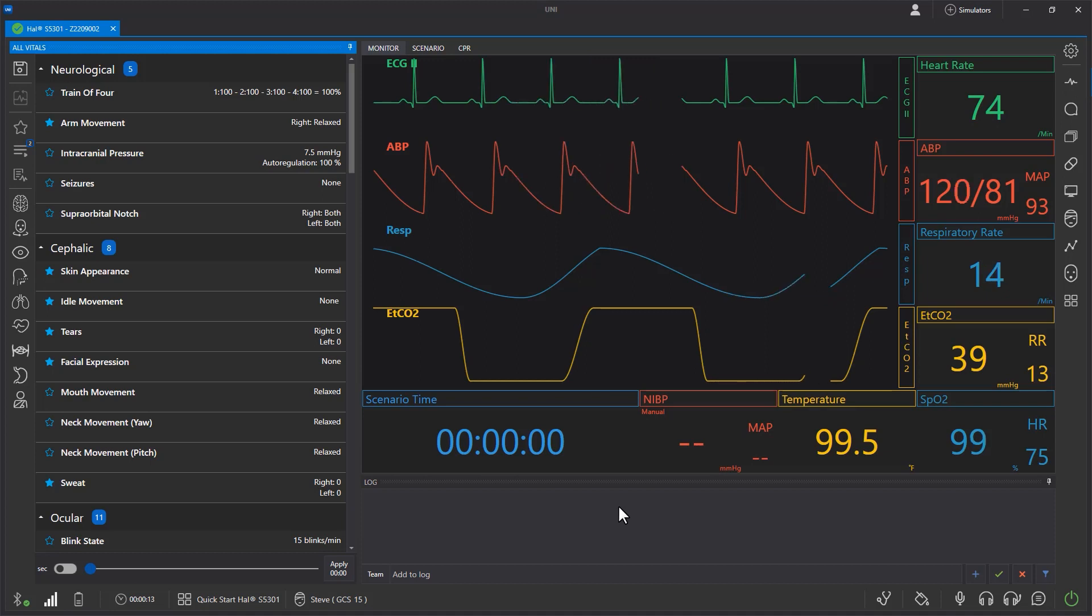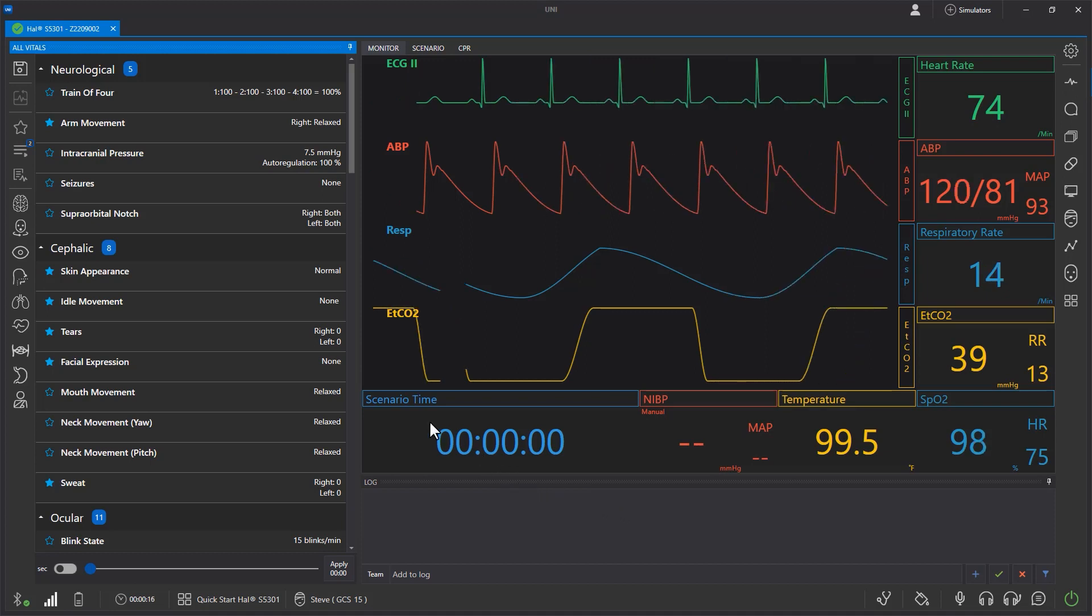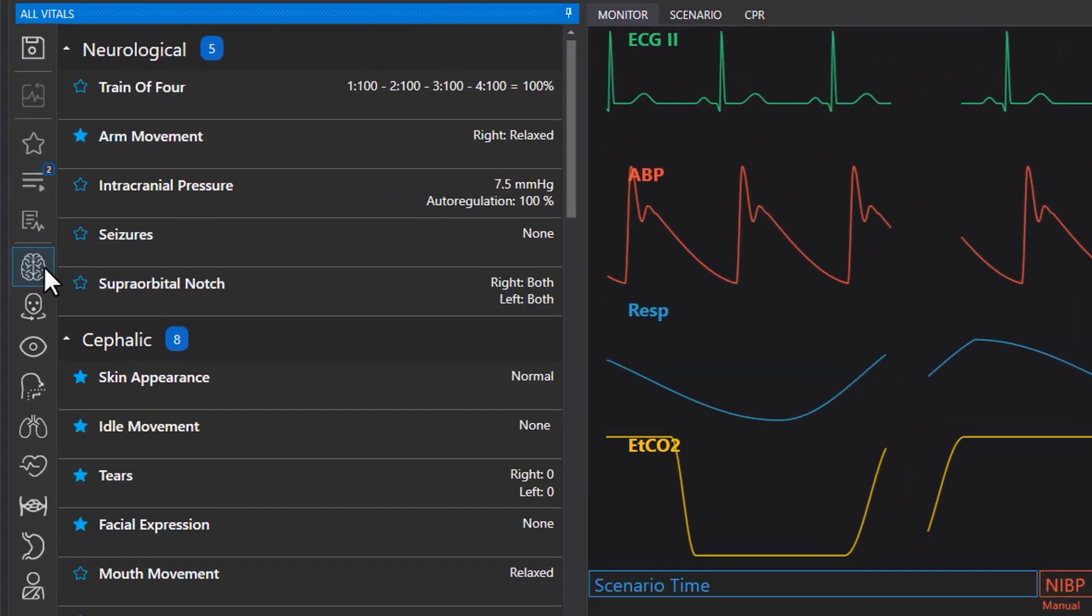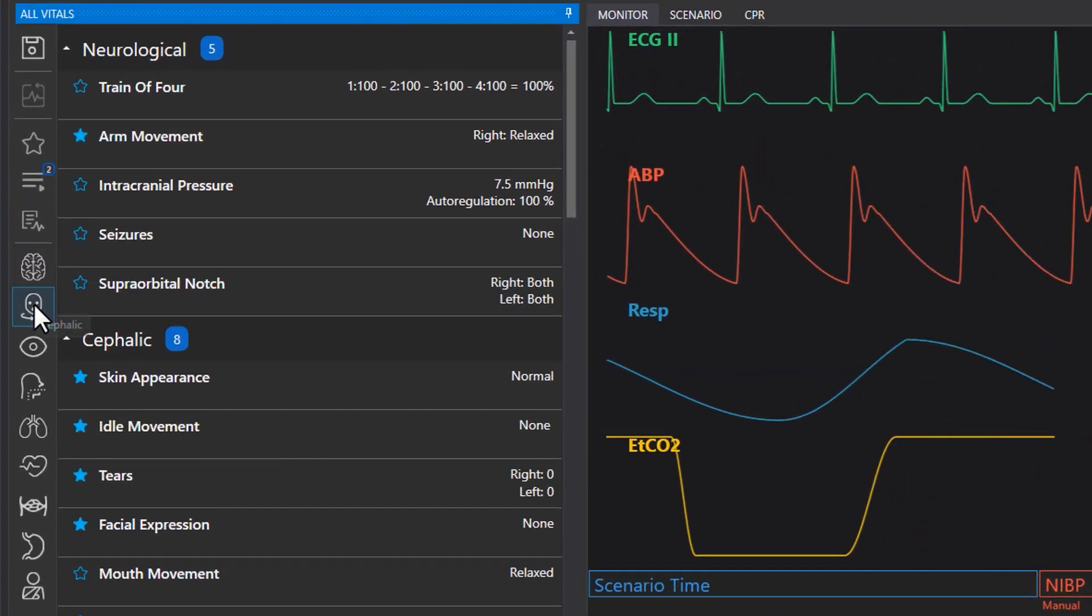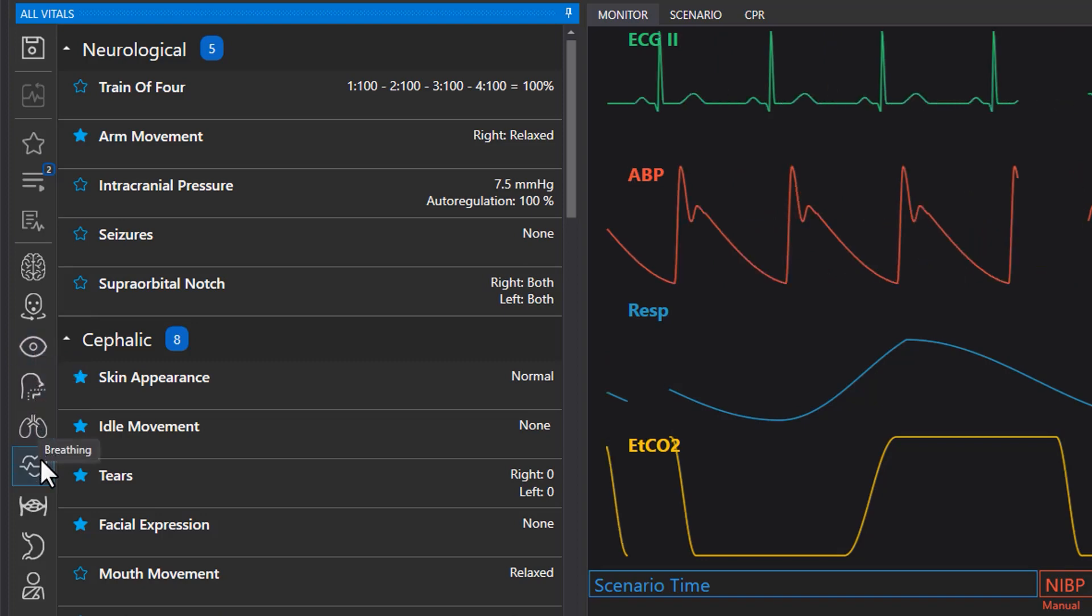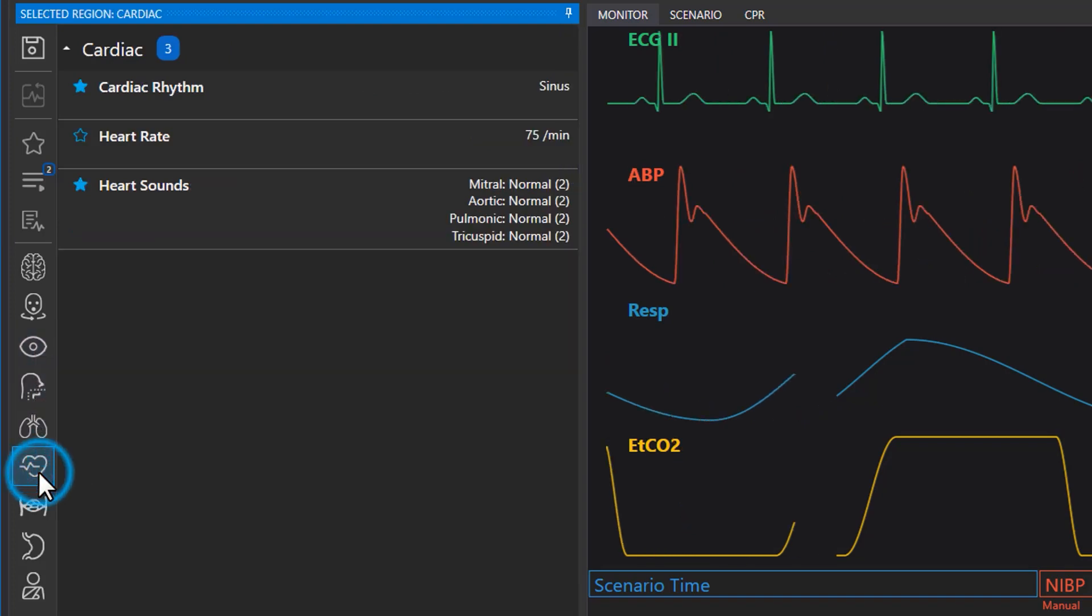Let's start by learning about the vital signs menu in UNI 3. For easy navigation, vital signs are categorized into groups on the left side. The vitals are presented in one of three formats: quantitative, qualitative, or on and off.